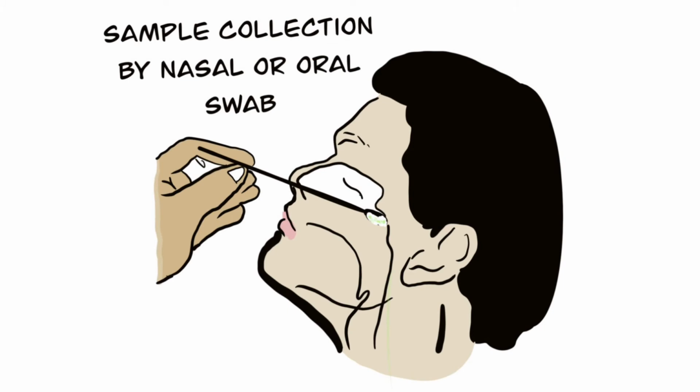Let's begin. I think everyone knows how the sample is collected. It is collected using a nasal or an oral swab or a nasopharyngeal swab, using a swab stick, followed by the collection and transportation of this sample in sterile conditions to the labs to perform the PCR test.